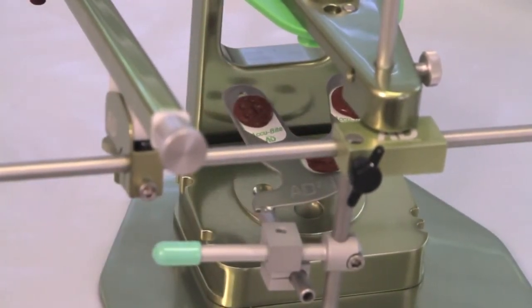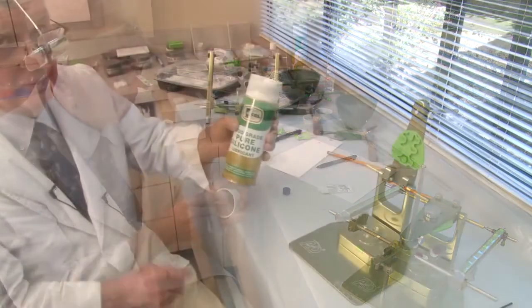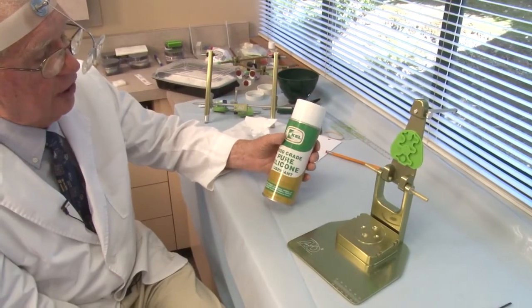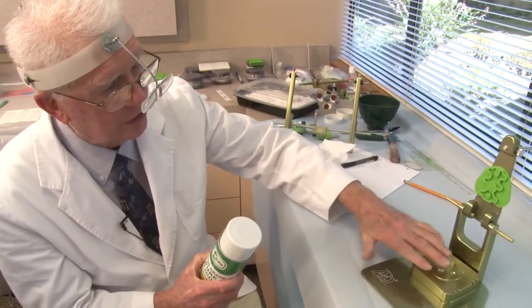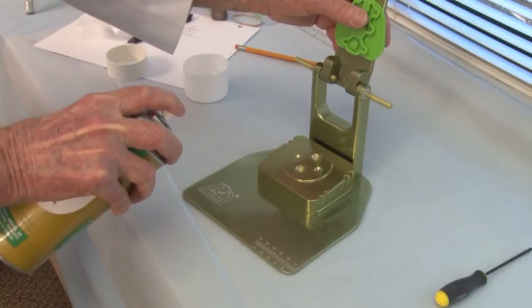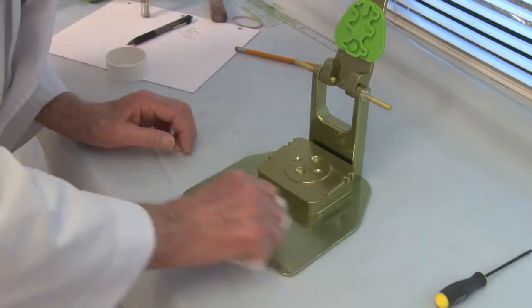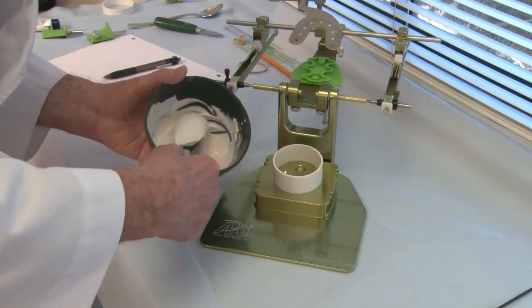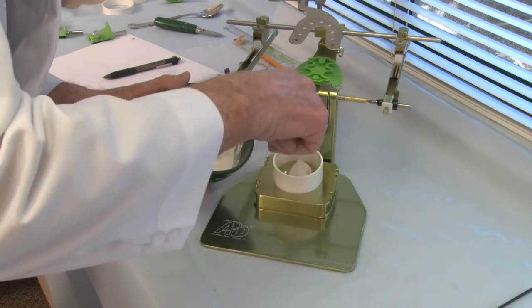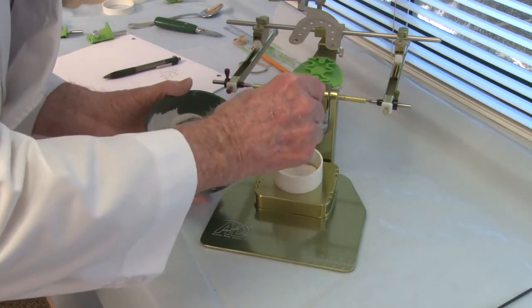So I'm going to take a little Aquaphor, put inside this ring. To protect the instruments, a very thin coating of silicone spray will help protect the instrument. So I'm going to put a little silicone spray in this area here. We're going to put the Whip Mix mounting stone in, the first amount I vibrate into place so that I get it into the indentations.